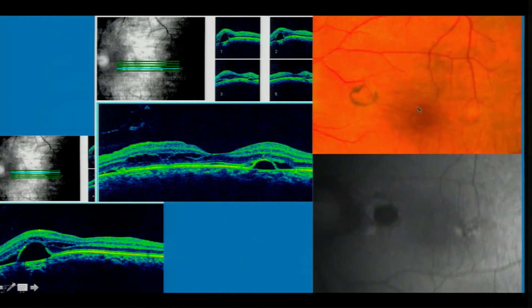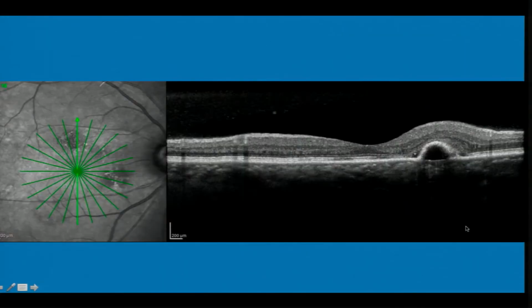So basically we have two serous PEDs, one pigmented, one non-pigmented, and if we look carefully, this pigmented PED corresponds to this one and the RPE is missing. So this is being seen as a hypoautofluorescent PED, but the temporal one is being seen as hyperautofluorescent because of the chronic lipofuscin deposit. Coming to the last PED, there are again two PEDs, here and here.